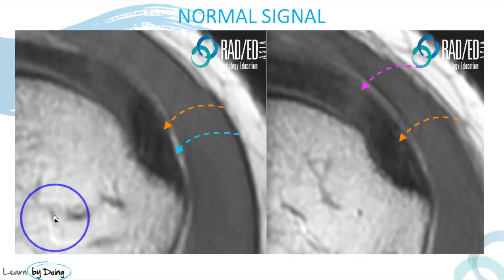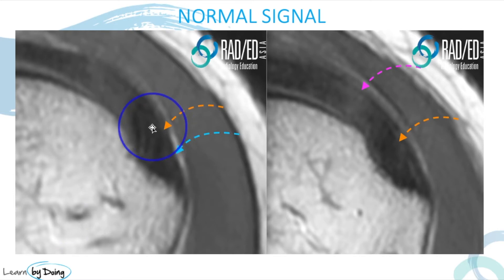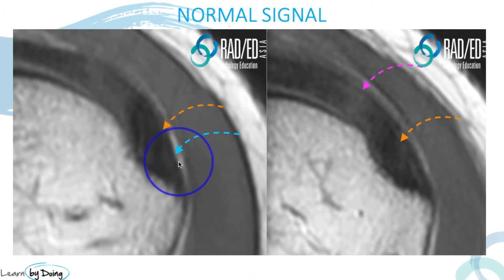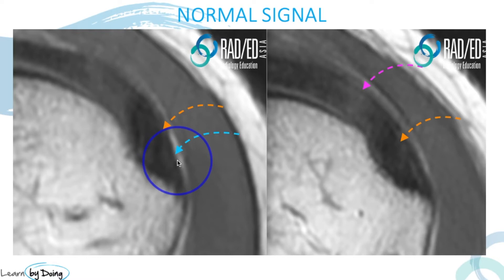The normal signal within a rotator cuff tendon is black on PD, PD fat sat, or T2. The orange arrow here is pointing to that low signal seen within the rotator cuff tendon. The other important thing about a normal tendon is to look at this interface — the edge of the bursal surface fibers is nice and sharp, with no irregularity. That becomes important when we talk about fraying of the tendon.